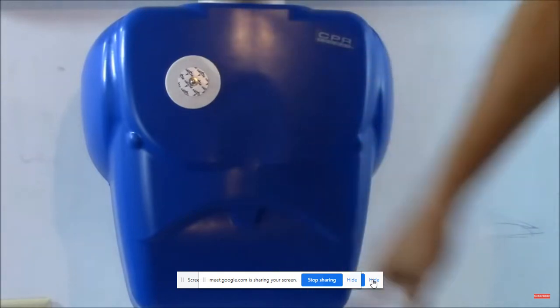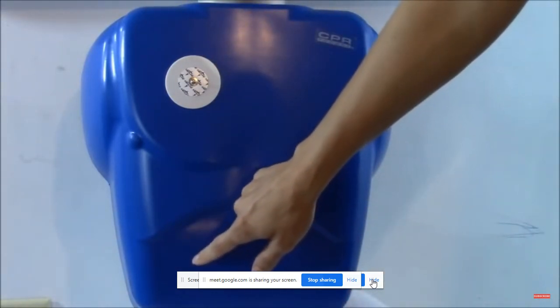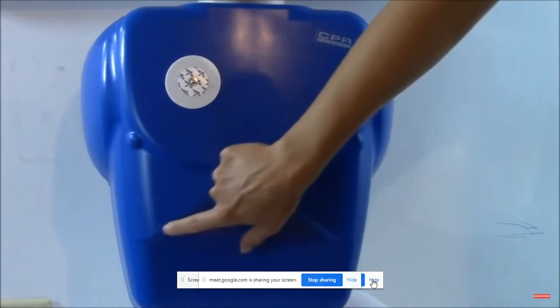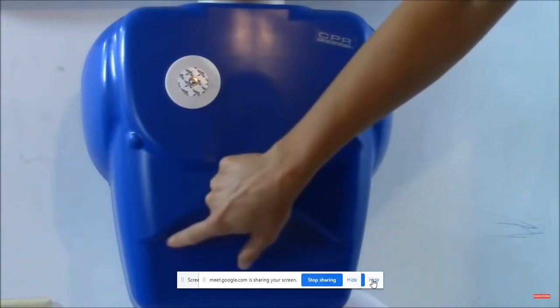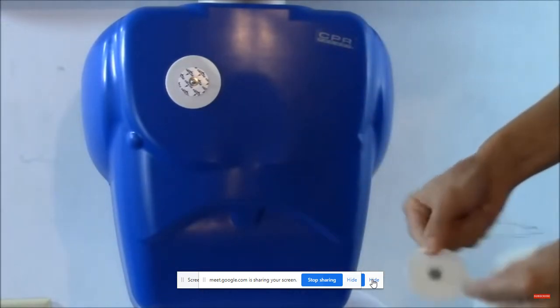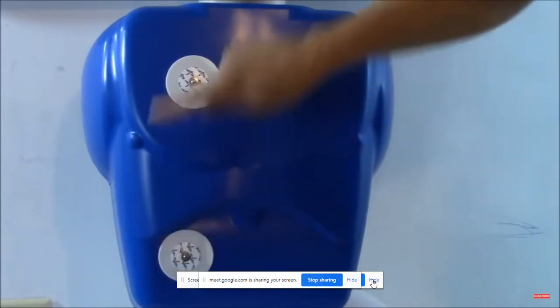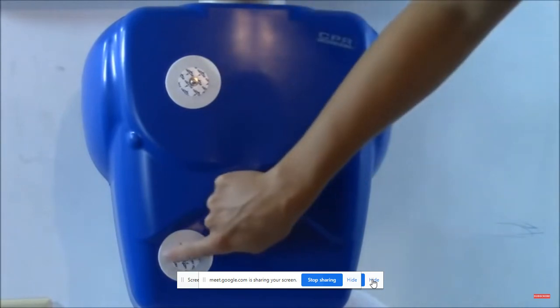And next you'll do your right leg lead, and this is the green, like we said, and it is down here right below the lower edge of the rib cage, which is right here on this mannequin. And it's on the non-muscular area, so you don't want to put it over the abdominal muscles. So you'll do the same type of prep. You'll clean with alcohol, and you'll lightly scratch, and then you'll put your electrode on. So we have right arm, right leg, and we have snow over grass.